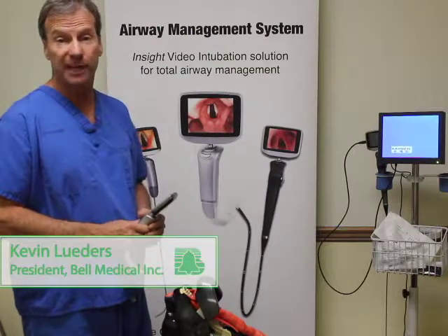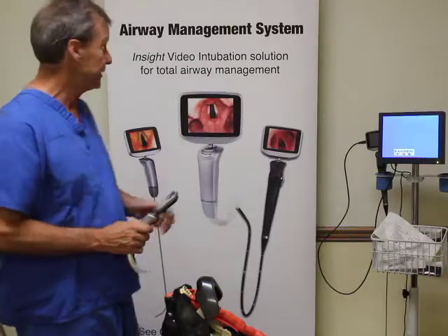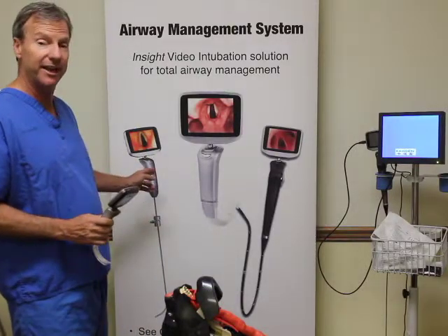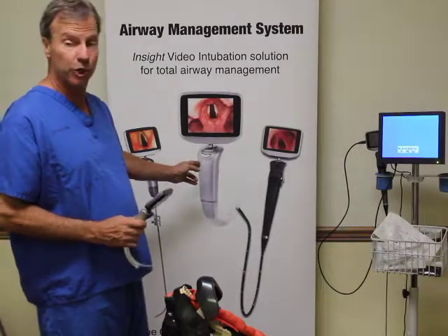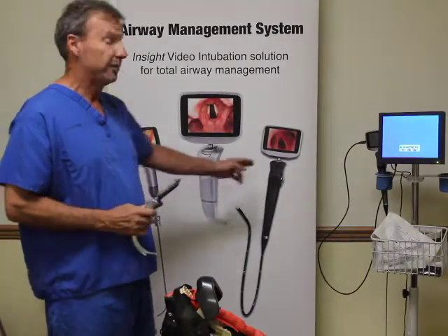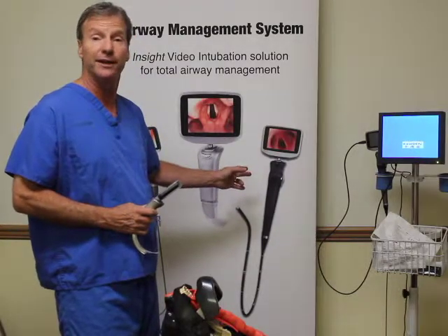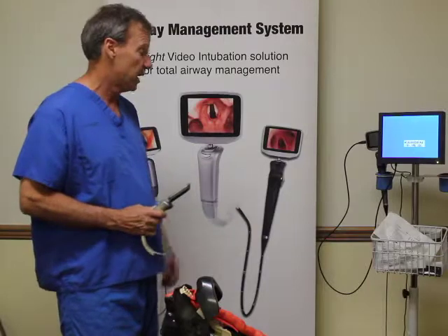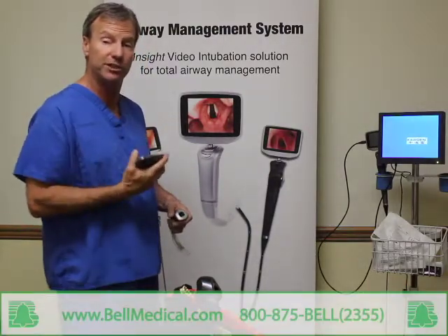I'm Kevin Luters with Bell Medical and I'm excited to show you the Insight Airway Management System. It's composed of several components: a rigid lighted stylet, a video laryngoscope, which we're going to talk about today, and four different sizes of flexible endoscopes for doing things such as verifying a double lumen tube placement. All of them use a removable display that can be shared between each device.